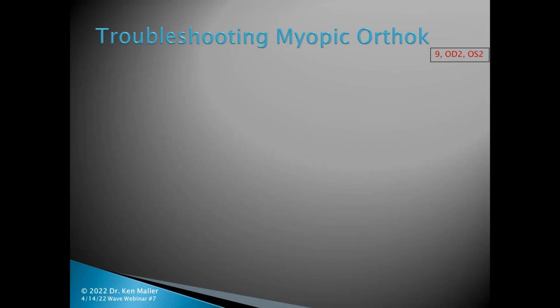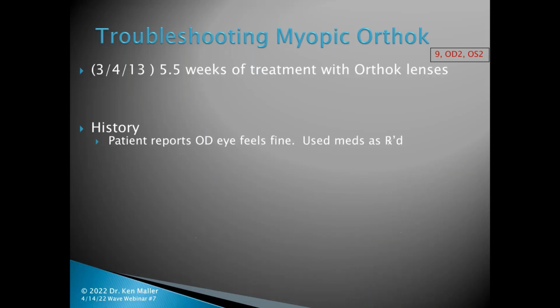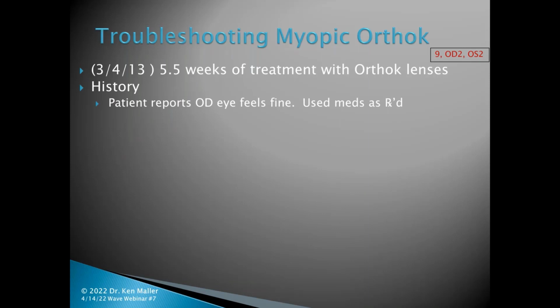So he came back 2 days later for his 9th visit. He's 5.5 weeks into treatment with his Ortho-K, and he reported that the OD feels fine now. He used the medication as prescribed.